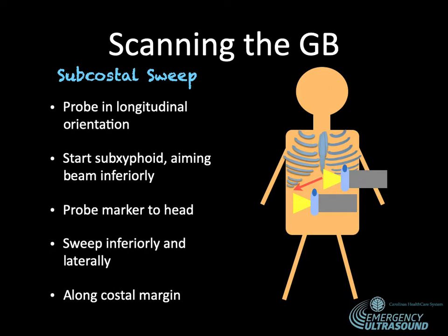So how do we get started? I should back up and say, like any other abdominal organ, we are going to want to use a low frequency ultrasound probe. So either your curvilinear probe or your phased array probe, and curvilinear is really going to be the best for this if you have a curvilinear probe.